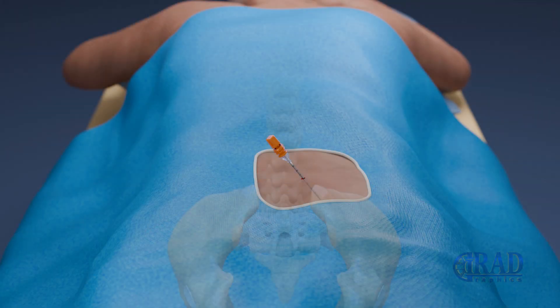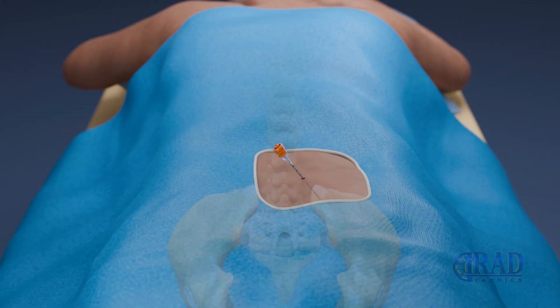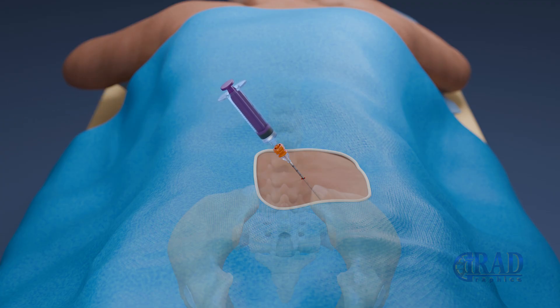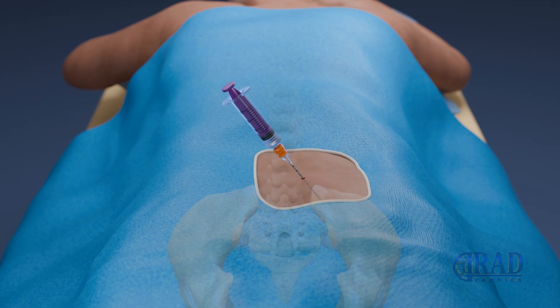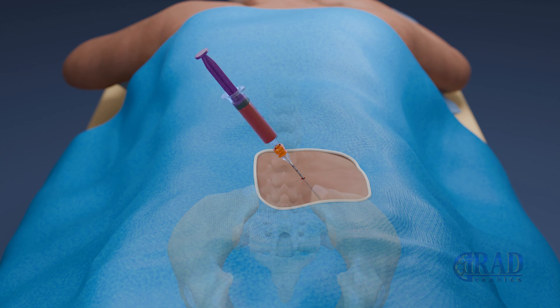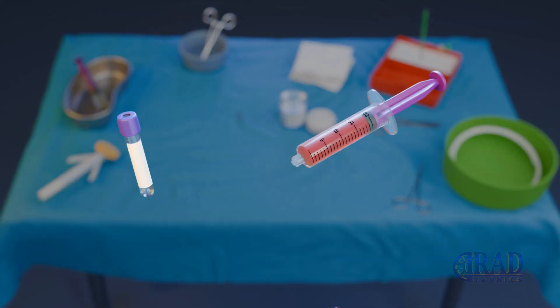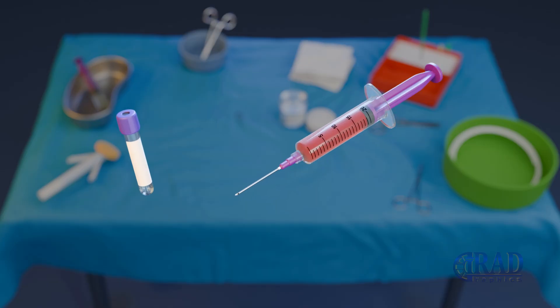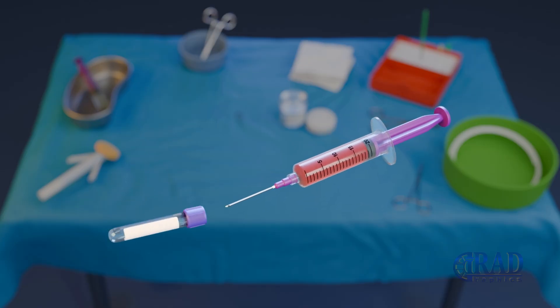The stylet is removed, and a large heparinized syringe is attached to the needle hub. Negative pressure is applied to aspirate liquid bone marrow, which is then collected into specialized tubes. In some cases, pathology slides are prepared at the bedside for immediate assessment.